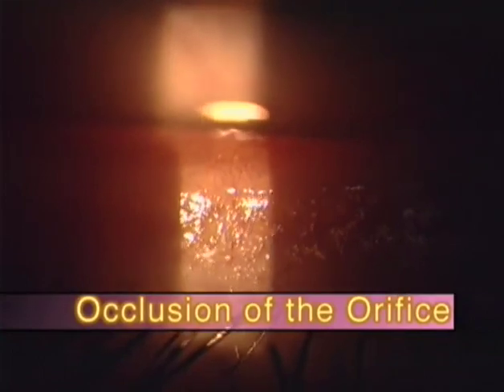In contrast, an occlusion of the orifice can be suspected when there is no wet reflex and the rugged dry reflex has extended over the orifice. This indicates that keratinized epithelium has covered the area of the orifice.